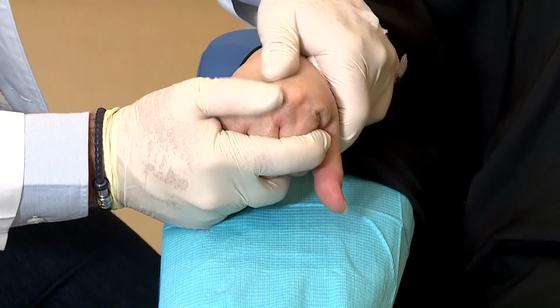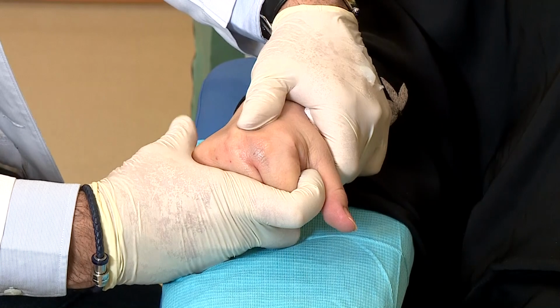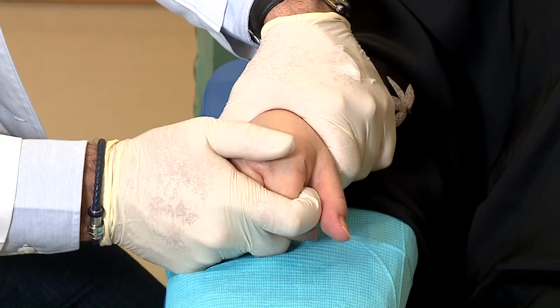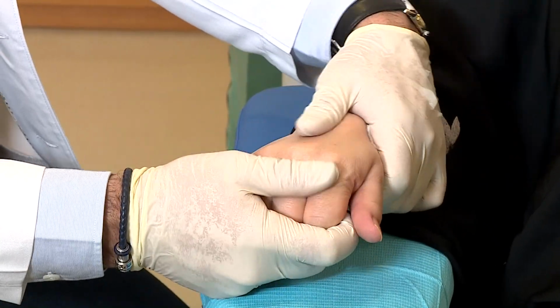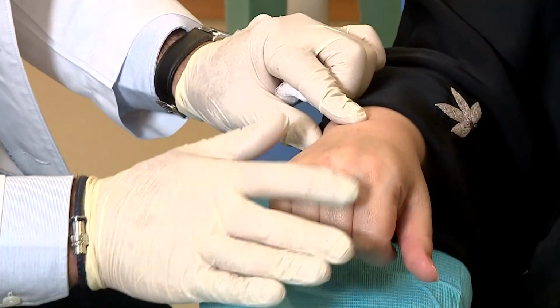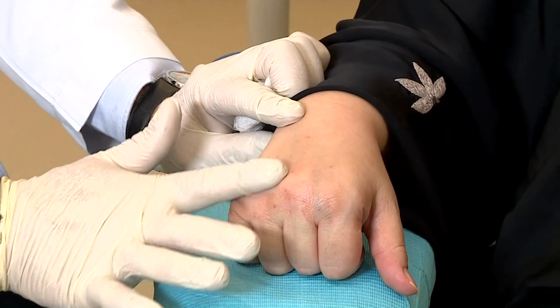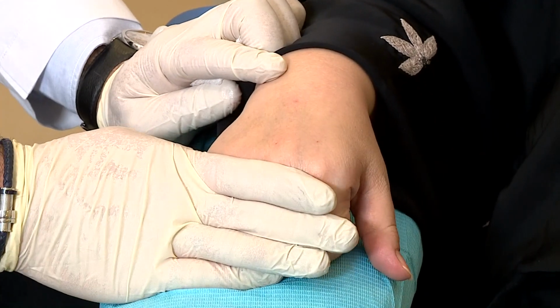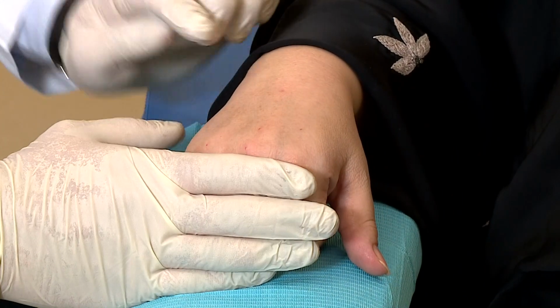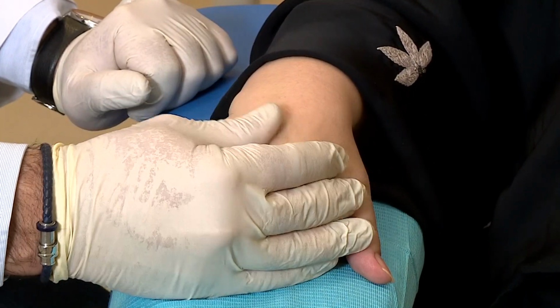Prior to the procedure, we only applied numbing cream over the dorsum of the hands for 45 minutes to give the patient more comfort during the procedure. Also, we ask the patient to massage it frequently in the following 2-3 days, and it will be fine. I always advise to reassess the patient in 2-3 weeks, and then maybe if the patient needs more, you can inject more. But in this patient, I think it's enough.